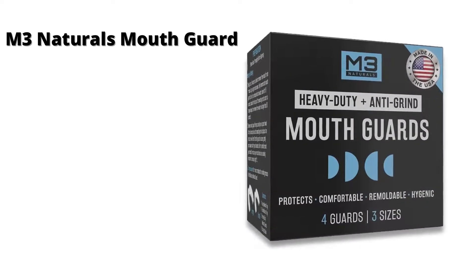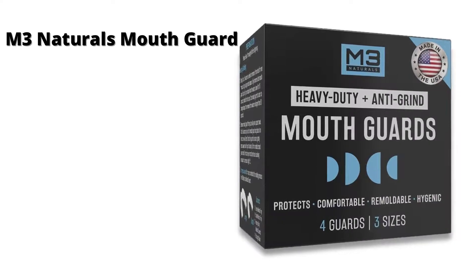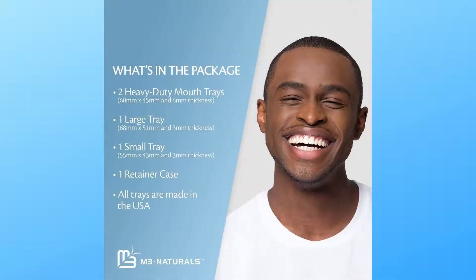M3 Naturals Mouth Guard for Clenching Teeth at Night — a dental guard and night guard with whitening trays for teeth grinding, BPA-free, available in 3-4 guards and 3 sizes. Enjoy a quiet and peaceful rest at night; our mouth guards are the ideal solution for nighttime teeth grinding and clenching, allowing you to sleep continuously through the night.